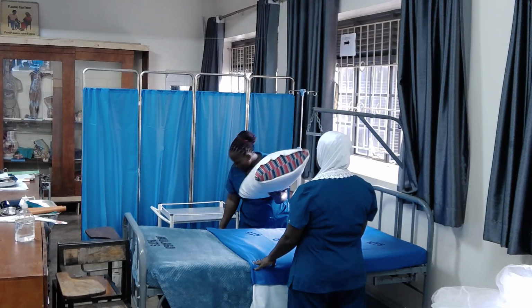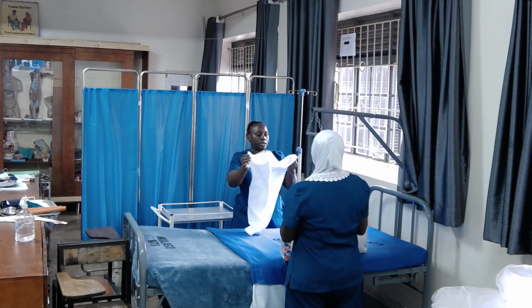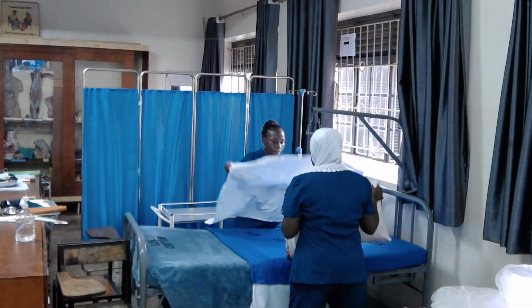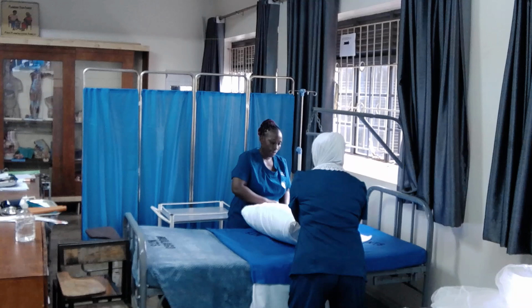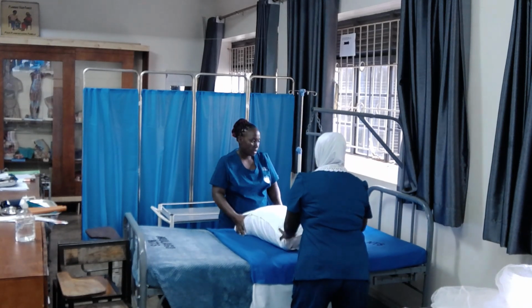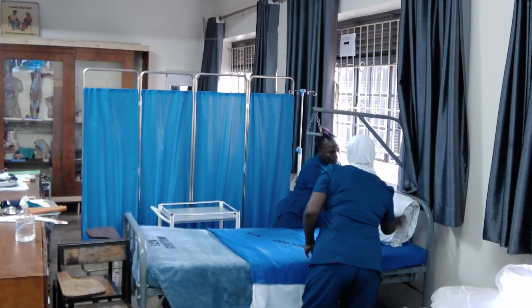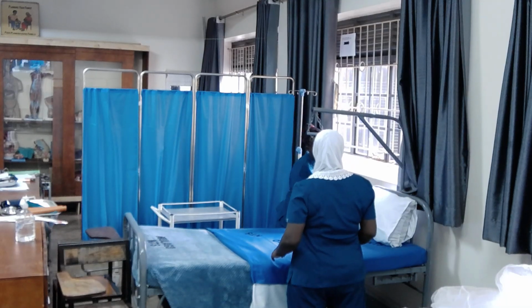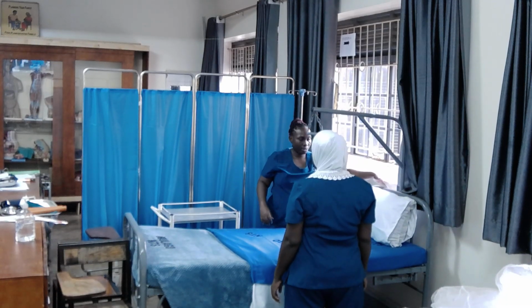So we get our pillow and wrap it in a draw sheet. And then we put it at the head of the bed, just like this. So you can use your draw sheet to hold it so the patient does not hit the bar of the bed.